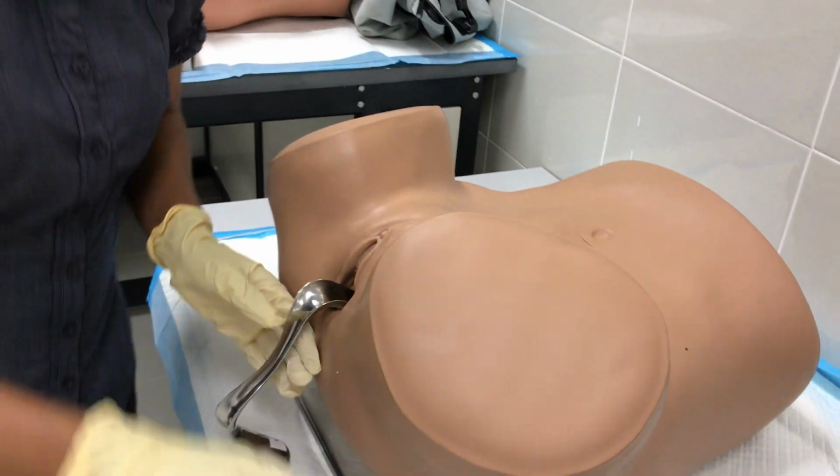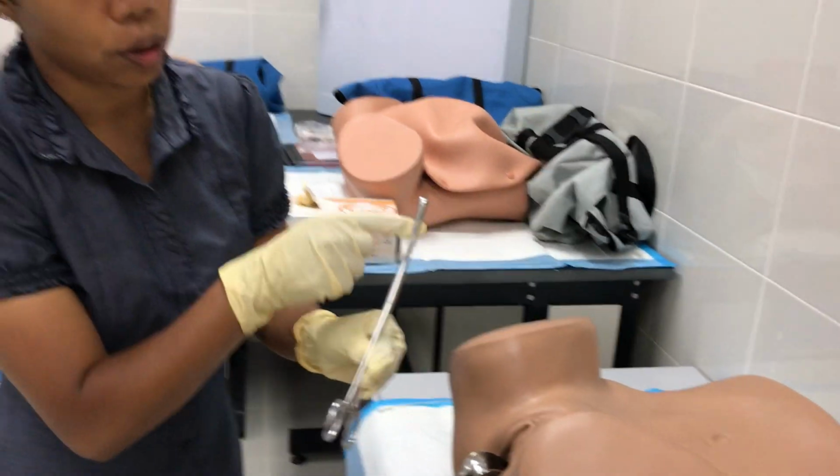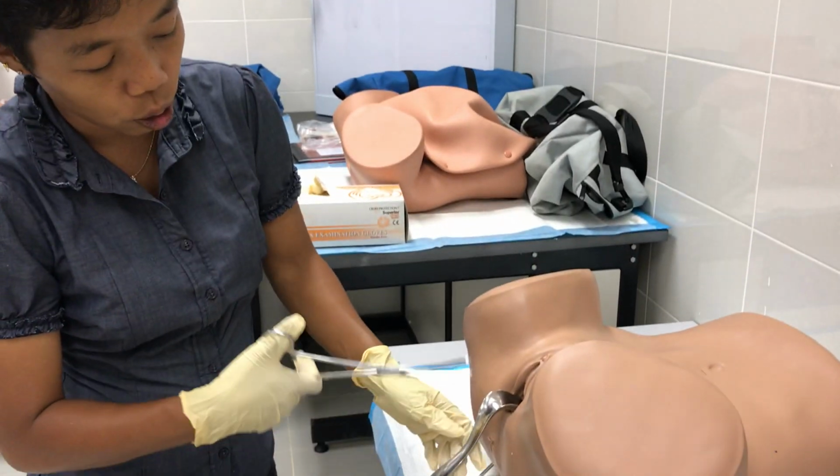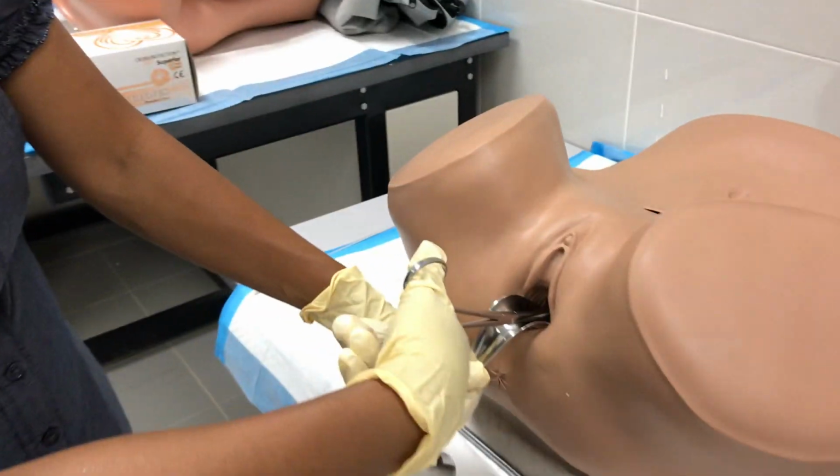Then you need to use a volsellum. This is a volsellum, a straight volsellum, so there will be the tip there. You have to clip it on the patient's anterior cervical os.